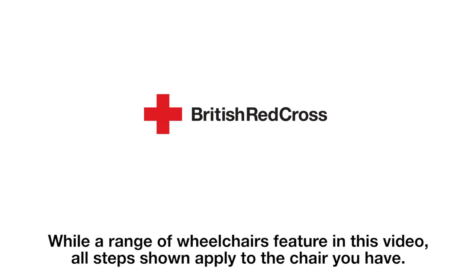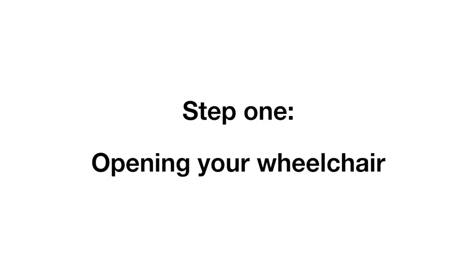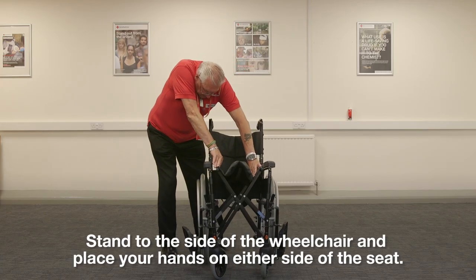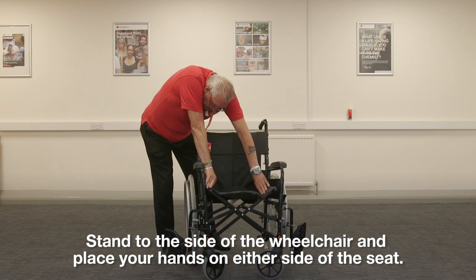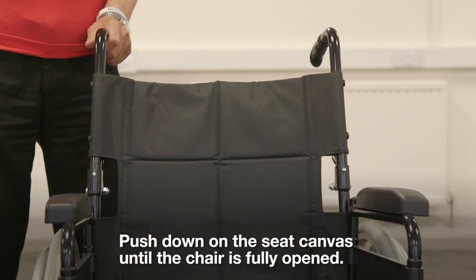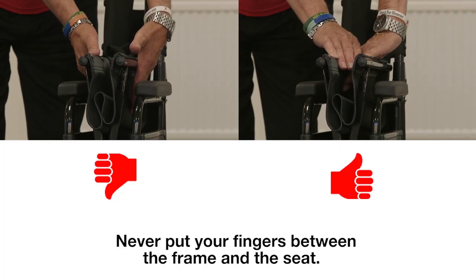While a range of wheelchairs feature in this video, all steps shown apply to the chair you have. Step 1, opening your wheelchair. Stand to the side of the wheelchair and place your hands on either side of the seat. Push down on the seat canvas until the chair is fully opened. Never put your fingers between the frame and the seat.